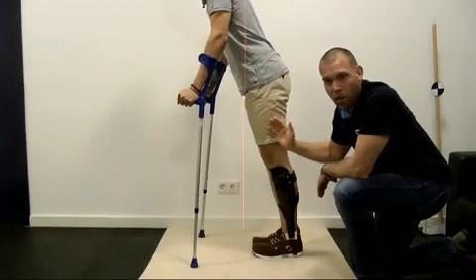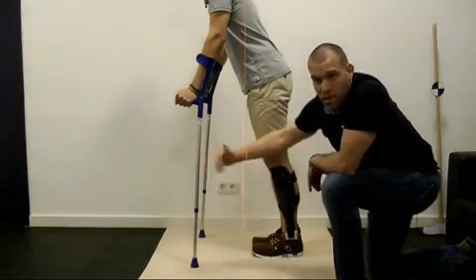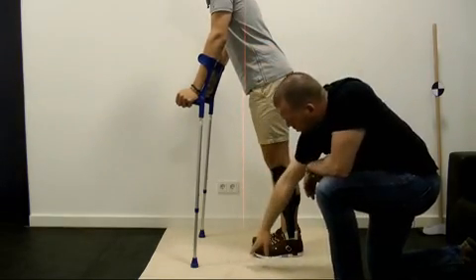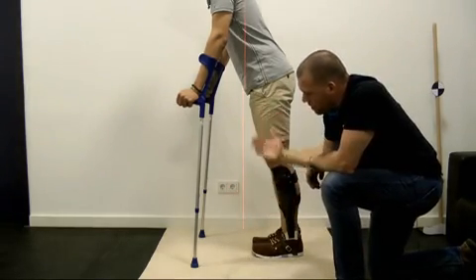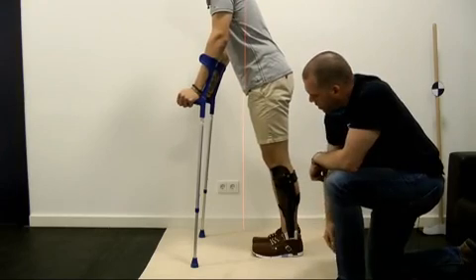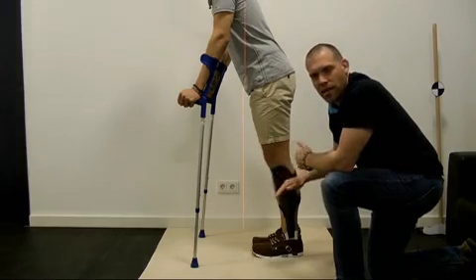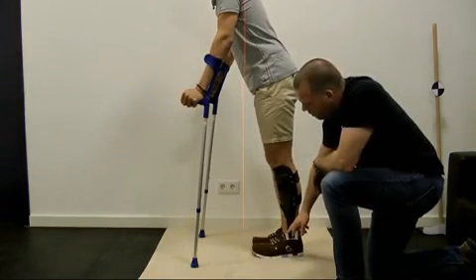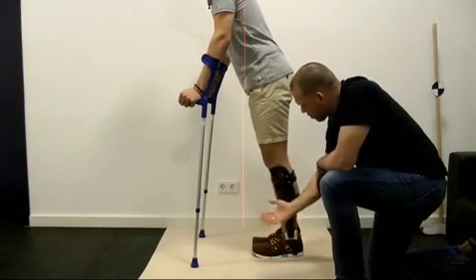That means he puts the forearm crutches far in front of him and becomes a four-legged animal like a pony. The plumb line from the center of the body falls between his feet and the crutches. In this situation, Henrik would not be able to stand upright according to our stability concept. And we should definitely not only check the static alignment, which we did before on the workbench, but also consider whether the spring used here in the front is really strong enough to apply the required extension moment to stabilize the knee.